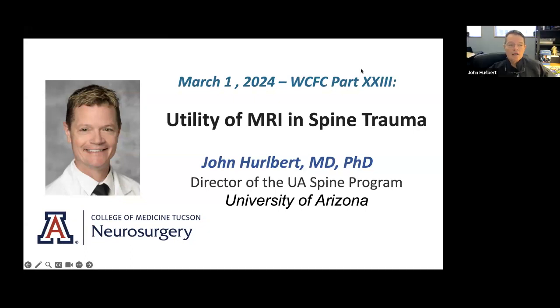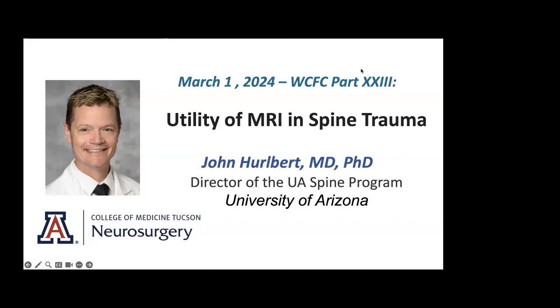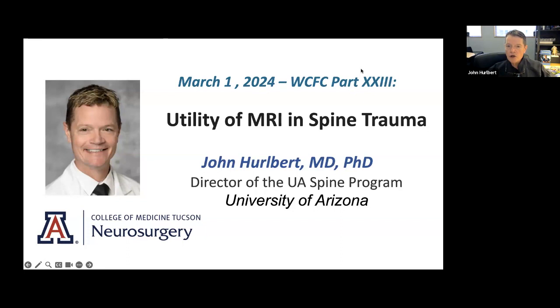Well, I think that's a great question, Greg, because one of the points I hope came out is that in 2 years, we see over 1,000 C-spine trauma patients, most of which are fine. So the number of patients that really fall into this category is very small. I'm not sure it's worth changing algorithms, but I do think it's important how we interpret them. I don't think MRI should be a trauma team tool or a radiology tool. I think it should be a spine surgeon tool when you're consulted to see a patient and you're not sure.